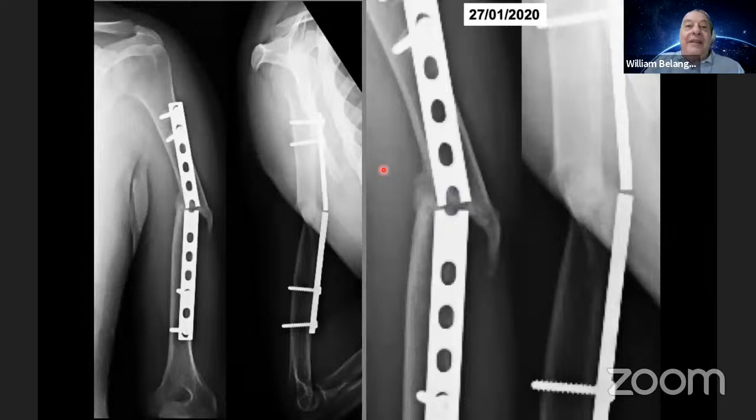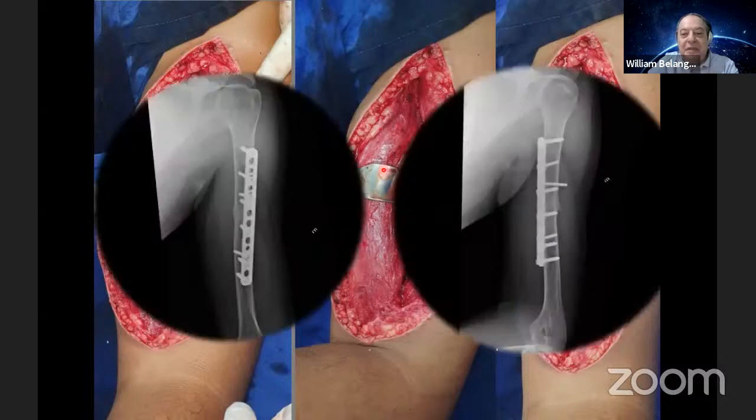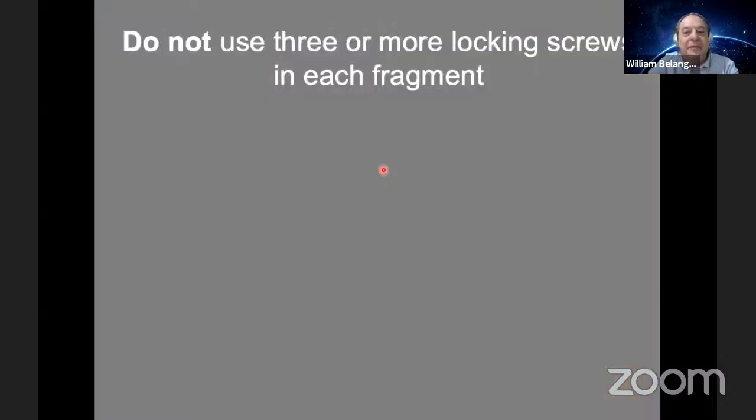Okay, we indicated surgery, but the patient asked for a while to solve some particular problems and came back 9 months after because he suffered acute pain. This is the X-ray, and you see, maybe if we waited a while, the fracture could heal, but we decided to treat it. We decided to make an open anterior approach and to treat this fracture. You see the fracture completely healed. Okay, the patient is okay now and returned to normal life.